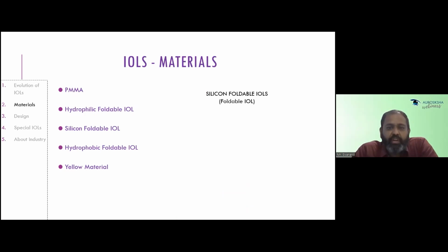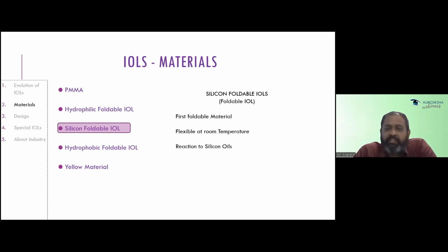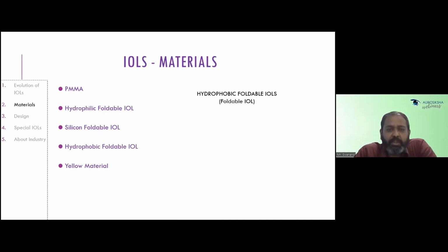The silicone foldable lenses, they are almost out of the market today. They came into the market. They are flexible at room temperature. But because of reactions to silicone oils, they have gone out of the market. So I'll not go much into this.